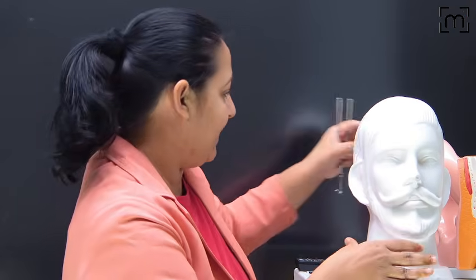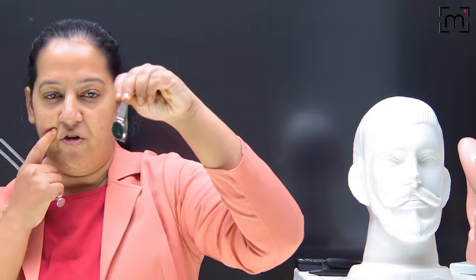Everyone, please focus here. The first two tests, Rinne's test and Weber test, I have already explained very well. And now I am explaining the ABC and the Schwabach in this patient model. So there is another way of doing this test. We should have a stopwatch. Suppose this is a simple watch, but suppose this is a stopwatch, for example.